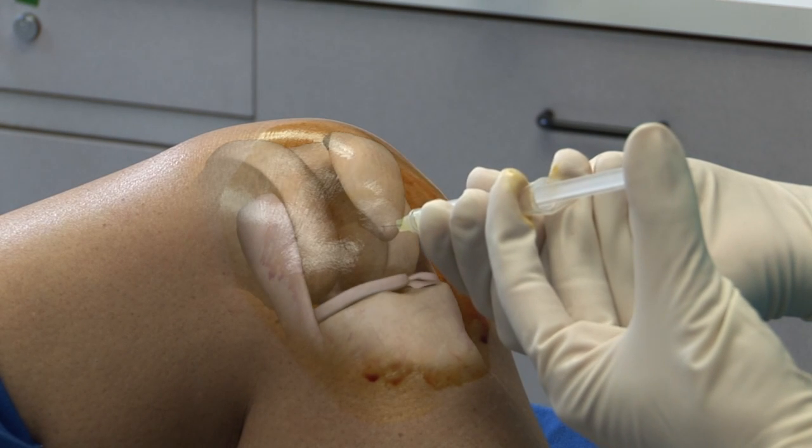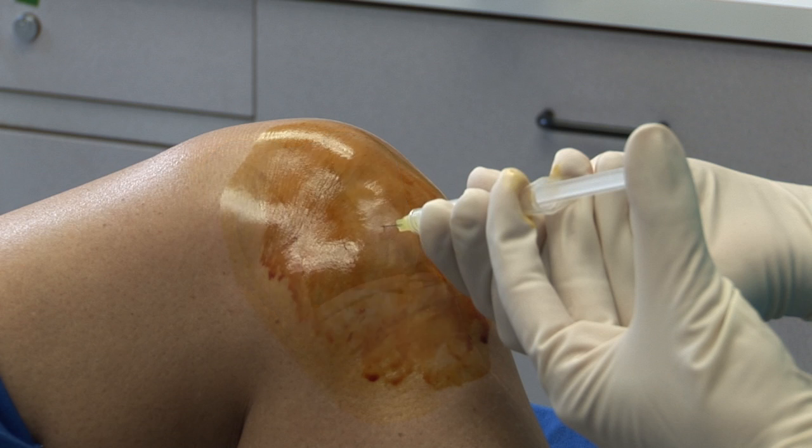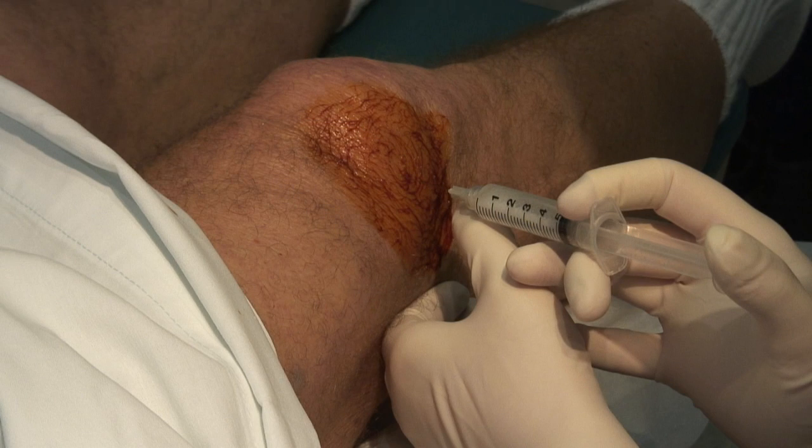Knee injection of steroids is a safe treatment for osteoarthritis or inflammatory arthritis of the knee joint. As with all joint injections, sterility must be maintained for any components used in the injection that enter the knee joint space.